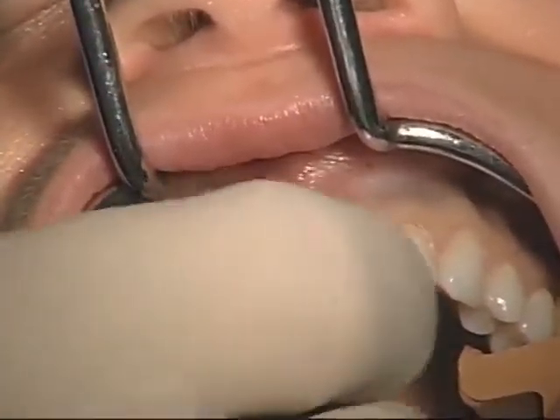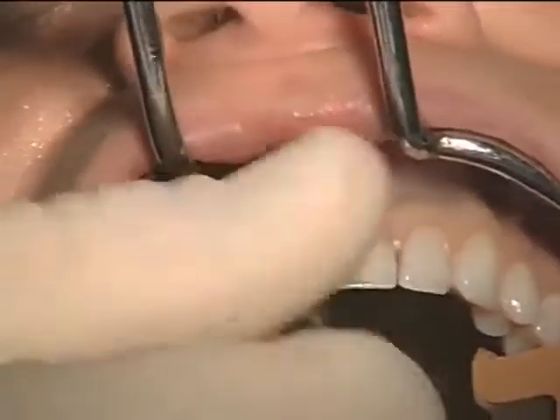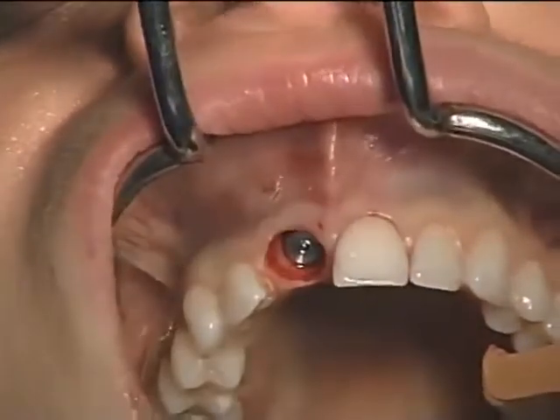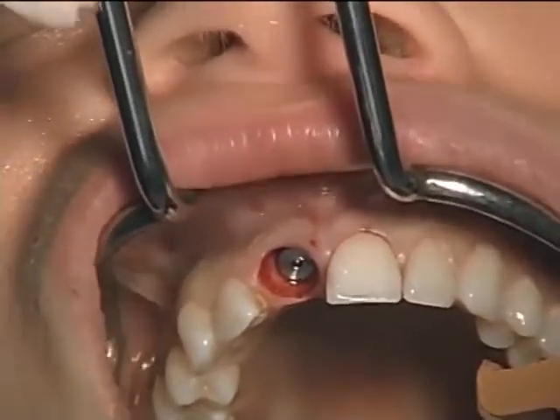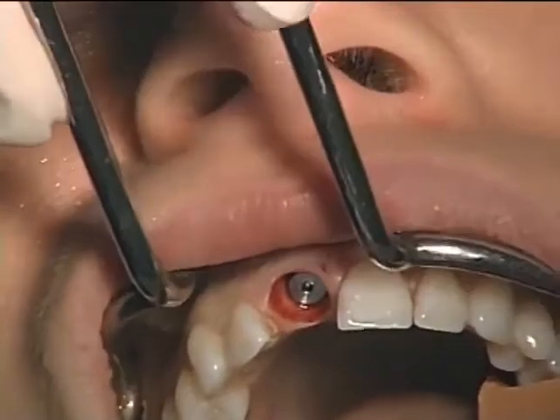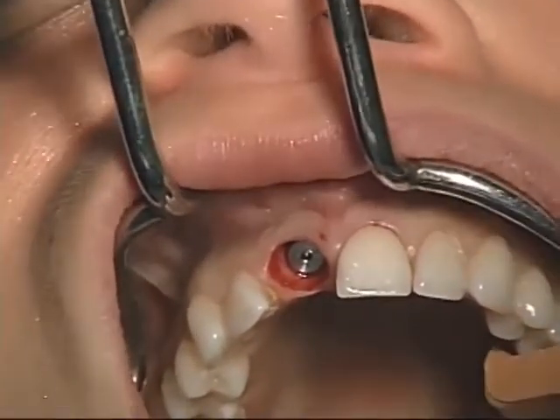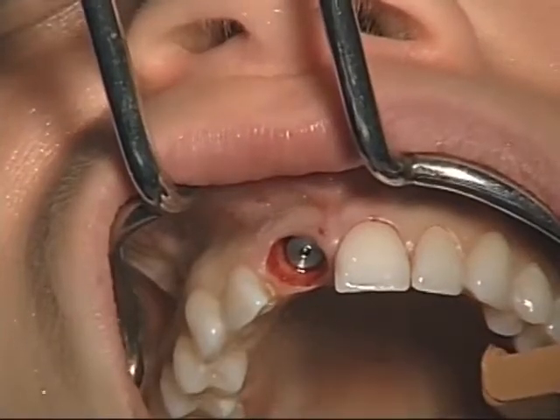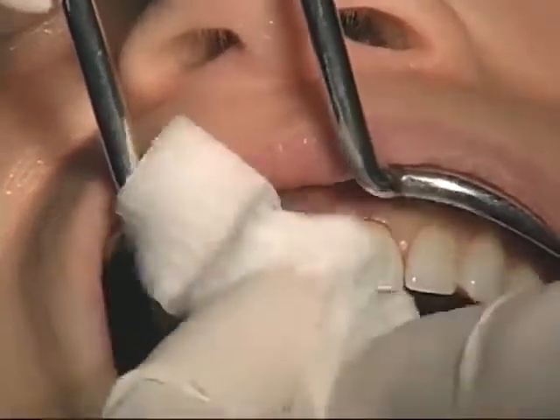Prior to preparation of the abutment, we will replace our cover screw over the implant so that we can complete our grafting procedures prior to retrofitting of the temporary. By placing the cover screw, we prevent any graft material from getting into the internal aspect of the implant. The grafting complex will be a combination of platelet-rich plasma enhanced Puros grafting material, the 1 to 2 millimeter particle size cancellous chips.